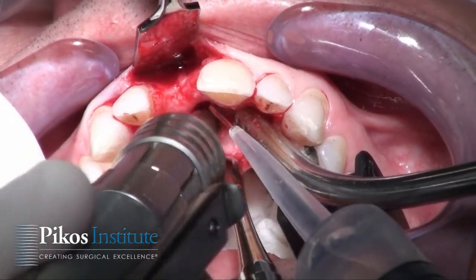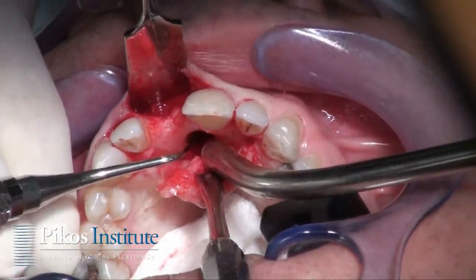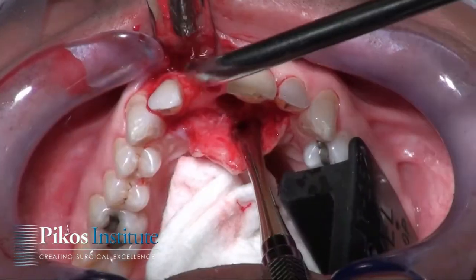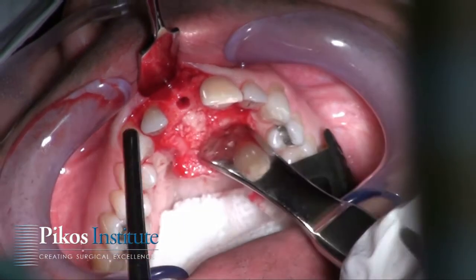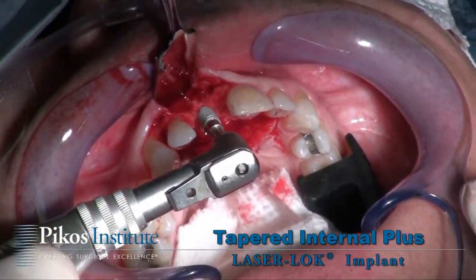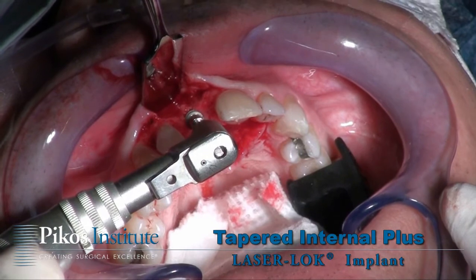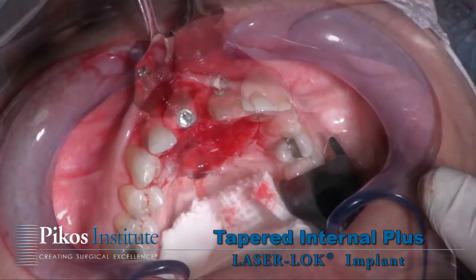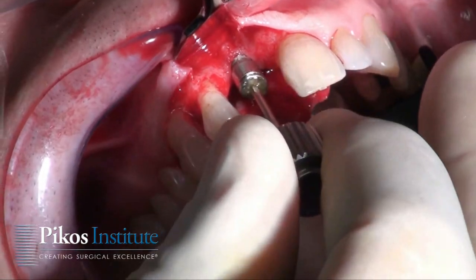Once I've burned it and cleaned it, there's the 8-round burr — really getting good bleeders and cleaning. There's my curette to clean out and burnish any residual tissue. You look at your scan and that'll dictate how far you can go down safely. But for the most part, I'm right to the end of it and I clean it. And if I have a membrane concern with the nasal mucosa — if I even think I have a perf — cut a collagen plug in half, squeeze it, and just thumb it right up in there. That'll protect, and then you graft over that.